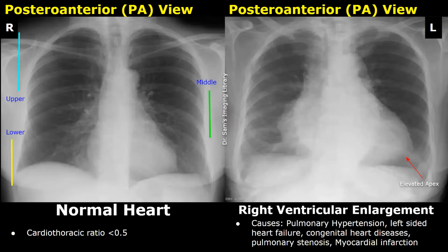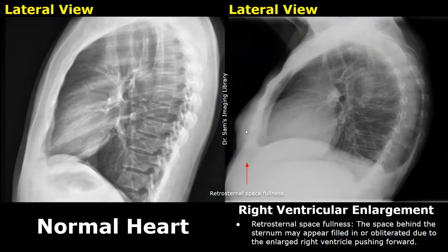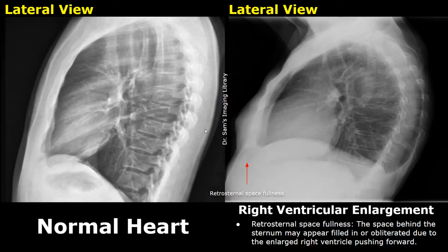Another feature seen in a lateral view is retrosternal space fullness. The space behind the sternum appears to be filled in or obliterated due to the enlarged right ventricle pushing forward — this region is bright or opacified. Whereas in the normal image we see a darker area here, as this space is not occupied by the heart.